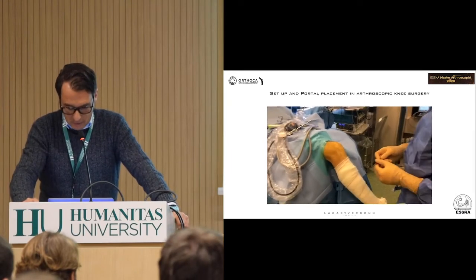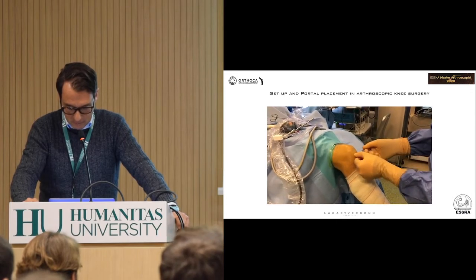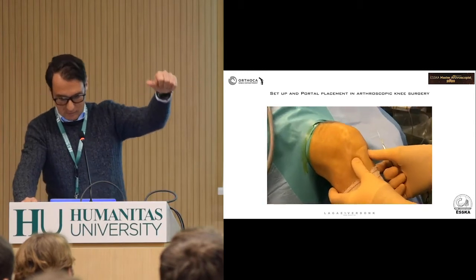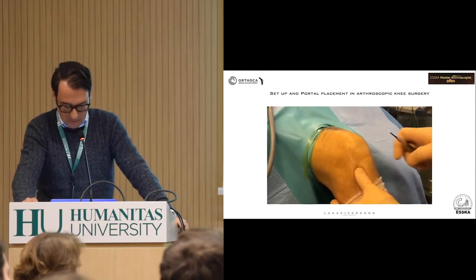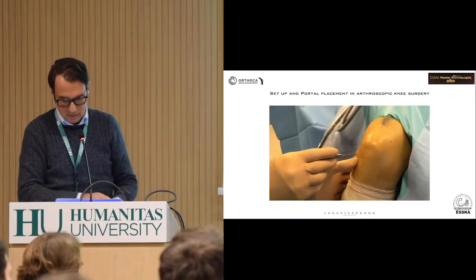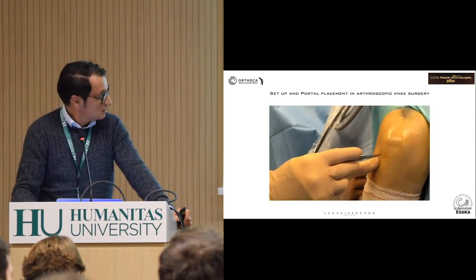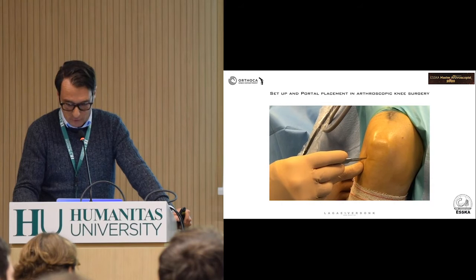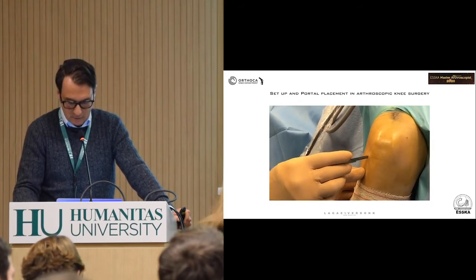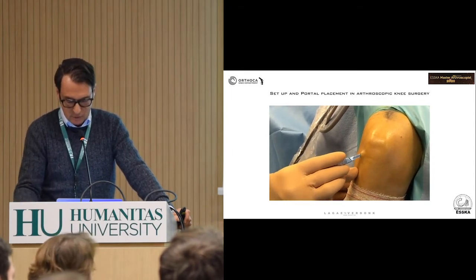This is what we did Monday. My nurse is cameraman, iPhone 10. My thumbs — I have small thumbs, only two centimeters. This is the height. I like to use a 15 blade; I hate 11 blades. Close it, keep going in the zone. First make a portal, turn next to the channel. First put the skin, then turn the blade around. I like to get, left of the portal, a little nick. Superior access makes it so much easier.